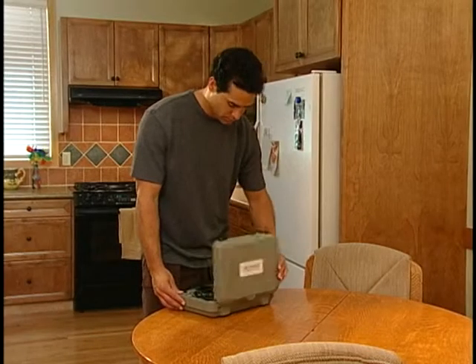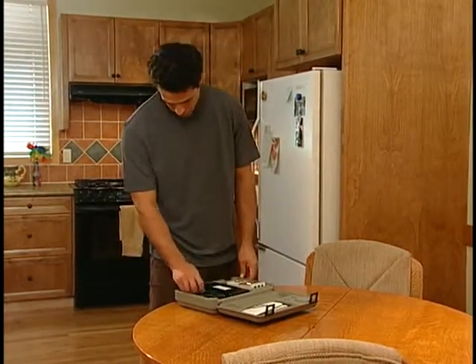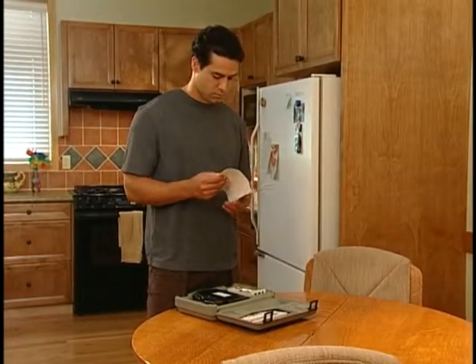You have just received an RS Medical stimulator. This video will show you how to use and care for the stimulator at home. However, it's also important to read the operation manual for detailed instructions.